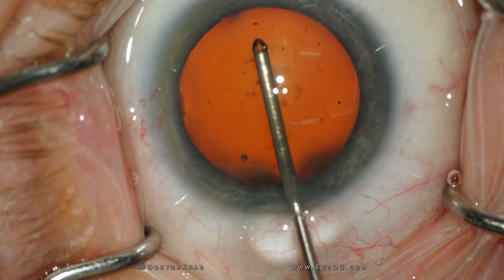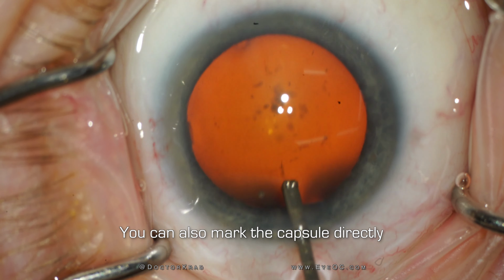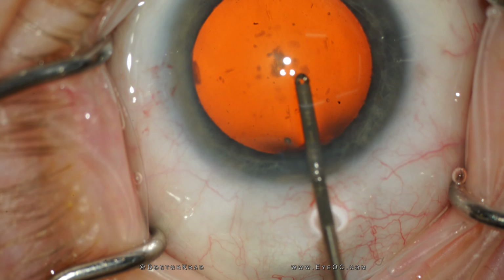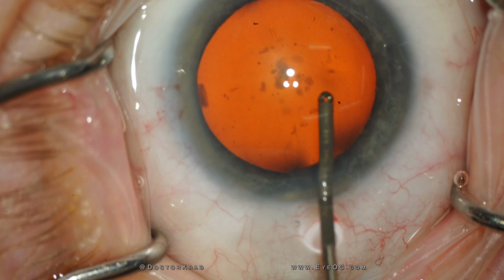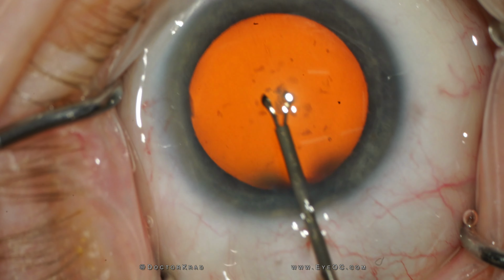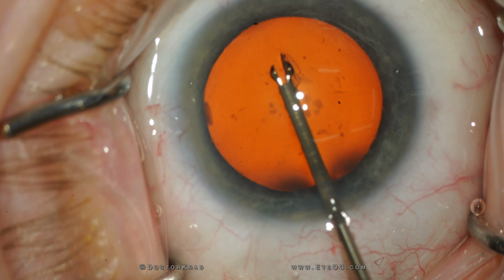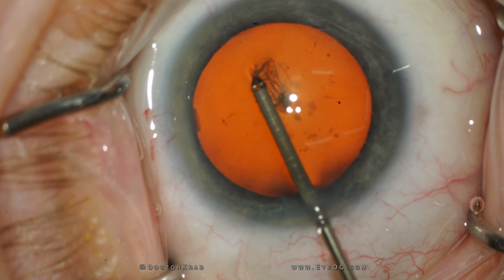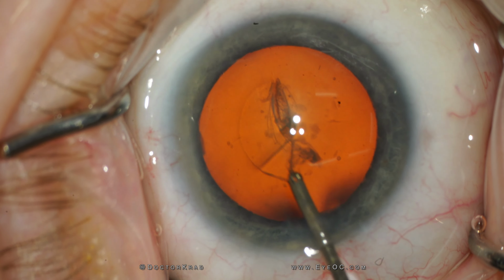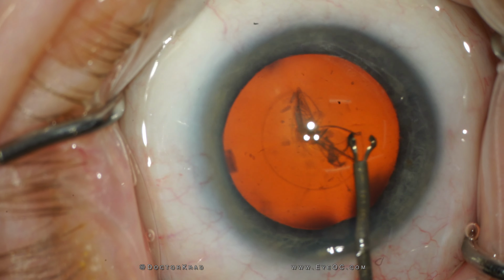I also tried marking the capsule directly, making little indentations to create a mark in the anterior cortex of the lens. These marks can help serve as a guide. They can act like parking cones that you want to drive around, and it's in the same plane as the capsule. This technique works well as long as you have a really good red reflex. I really love the new Zeiss scopes. If it's just nuclear cataract, you have a super bright red reflex. But it's hard to visualize these points if there are cortical changes or a more mature cataract.